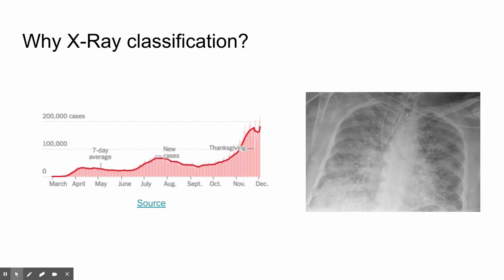So in 2020, the coronavirus has caused worldwide shutdowns, and in the US, cases continue to rise. Strong and efficient diagnostic tools continue to remain important in combating this, such as X-ray scans. You can see an example of a patient with COVID's X-ray scan on the right. While CT scans have a lower misdiagnosis rate historically, X-ray scans are faster, cheaper, and produce less radiation, making them more equipped for this situation.